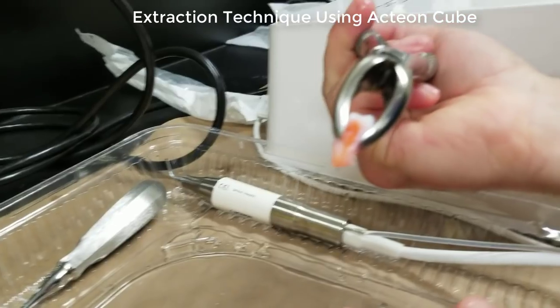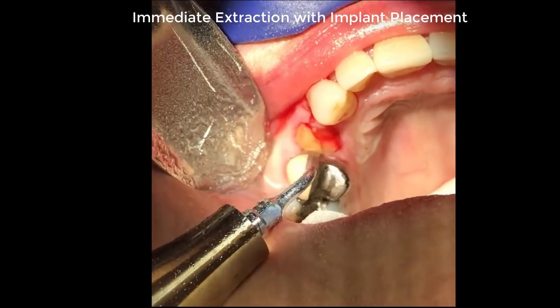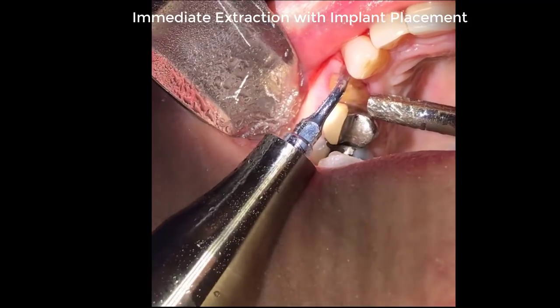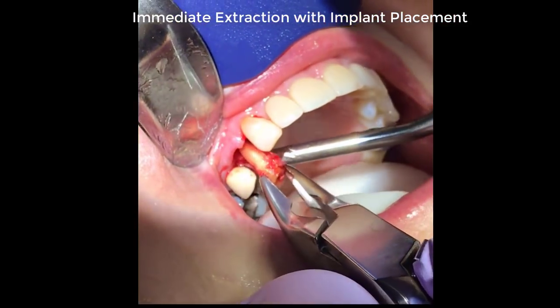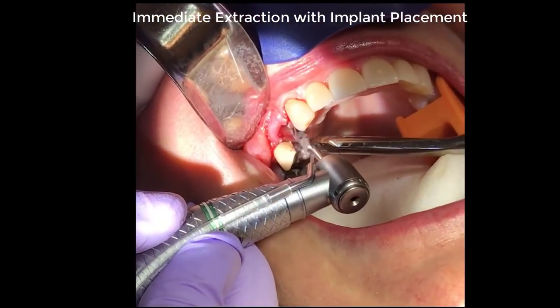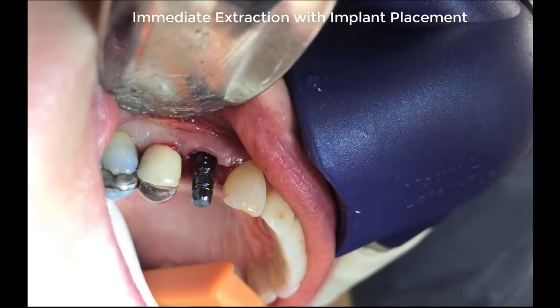We want to avoid overheating the tip and causing damage to the alveolar bone by letting the tip get too hot. As you can see in this video, we're bringing the tip out very quickly and letting the water cool the tip, then returning it to the osteotomy site, directing the tip apically along just adjacent to the root surface of the tooth. Once we've established an array of vertical osteotomies, we can connect that array by moving the tip circumferentially around the tooth and joining those osteotomy sites, without leaving the tip down long enough to let it get hot.